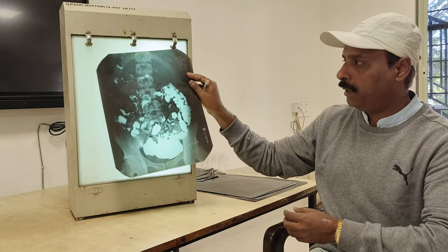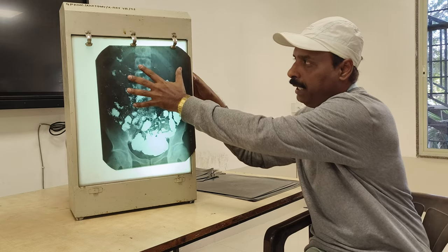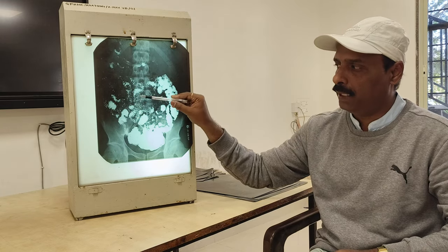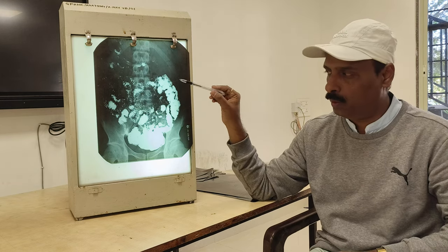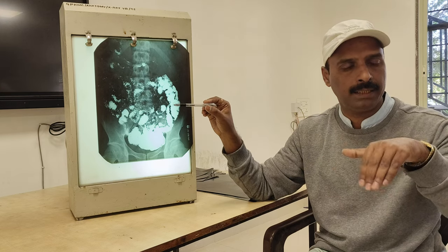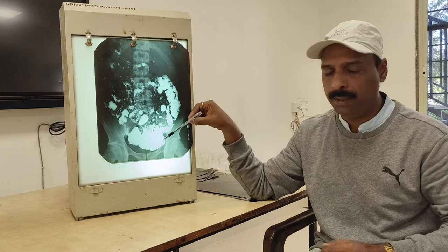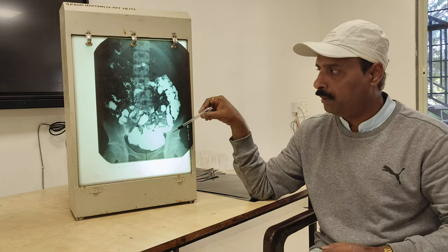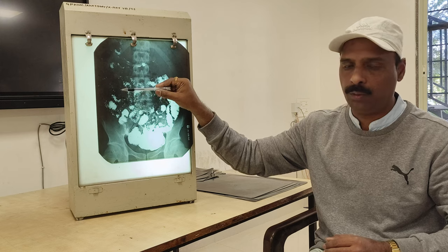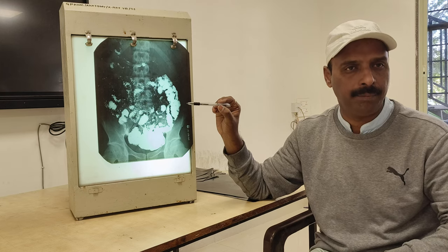Then what is a barium enema? I have told you that when a person is given an enema with barium, it covers almost all of the large intestine, reaching to the ileocecal junction. When a person drinks barium, it goes from the esophagus and stomach to the duodenum, small intestine, and ileocecal junction; that is barium meal and barium follow through. When we give a barium enema from the rectum, it enters the sigmoid colon, descending colon, transverse colon, and ascending colon. Then here is the ileocecal junction. This is what we call a barium enema.